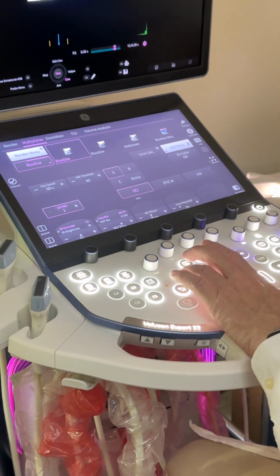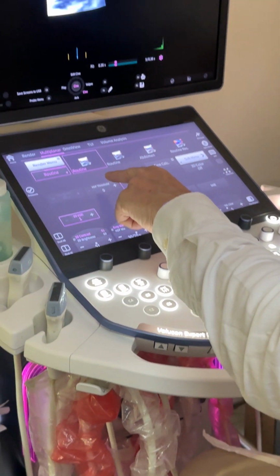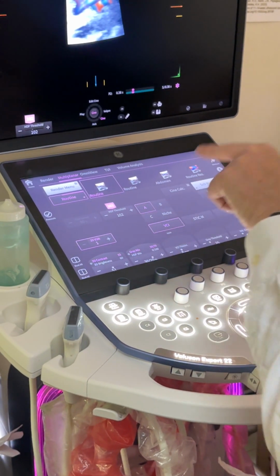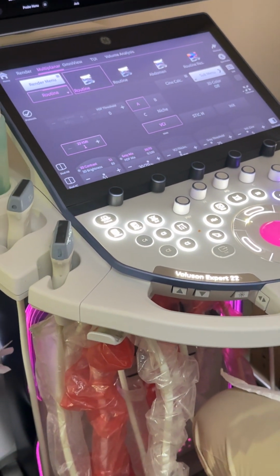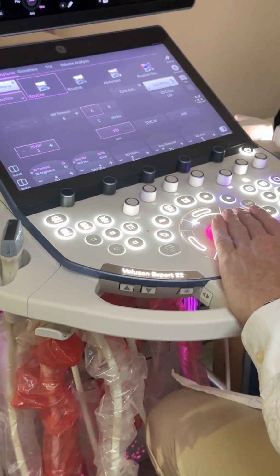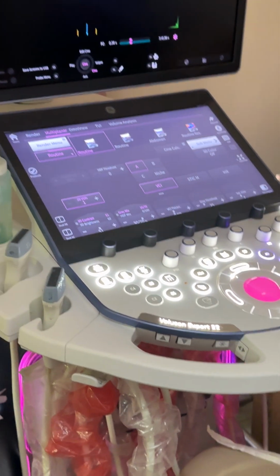So what you have here is you have the main... And you reduce your color threshold. That's what Long has just done. To bring the vessel into view, you reduce your color threshold. If you come up there, it wasn't visible. So what he did was, he held the threshold and he dropped the threshold. When you drop your color threshold, you write in more echoes. You write in more color. It's the exact same when you do with 2D. And when you write in the lower velocities, because you have a lower threshold for allowing the color to be read, it then brings it into view.